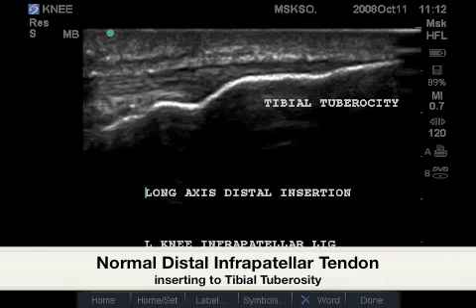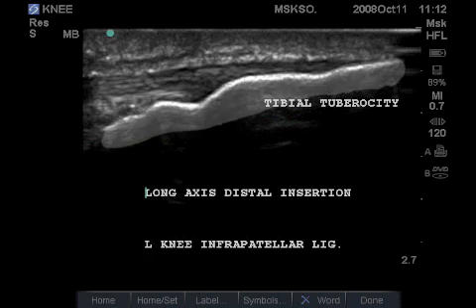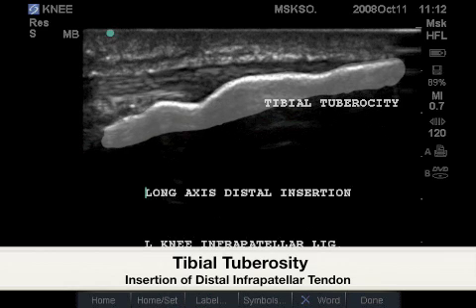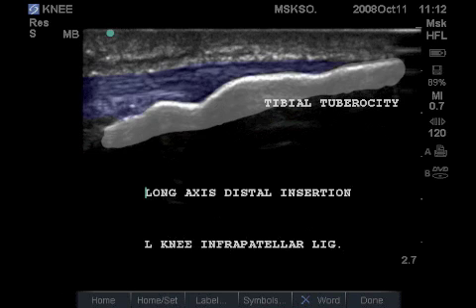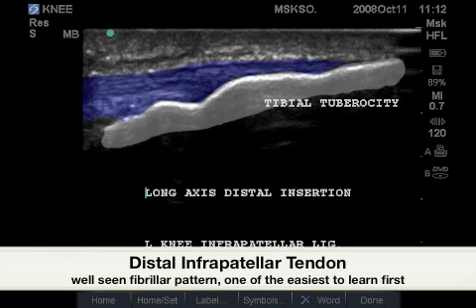In this image, we see a normal infrapatellar tendon as it inserts to the tibial tuberosity of the proximal tibia. Highlighted in white is the bony surface anatomy, and in blue is the fibrillar pattern of the infrapatellar tendon.